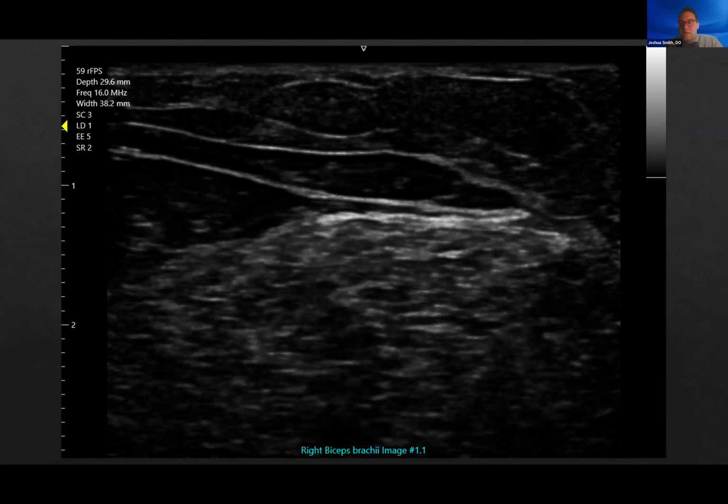For muscle biopsy, it does depend a bit on your institution too, right? At ours, I do core needle muscle biopsies in the EMG lab. So we'll do the EMG, I'll do the ultrasound, and I'll do their biopsy right there. And then they can go home with a steri strip and a compression bandage. But if you don't have that capability and you're thinking open biopsy, we've all run into that situation where they had one biopsy and it was kind of borderline. It wasn't too helpful. Maybe on the EMG, you're like, oh, the vastus, one of the quads, maybe isn't the best muscle to pick.